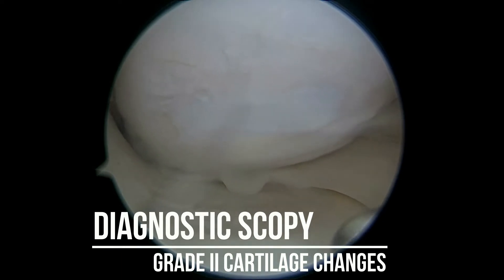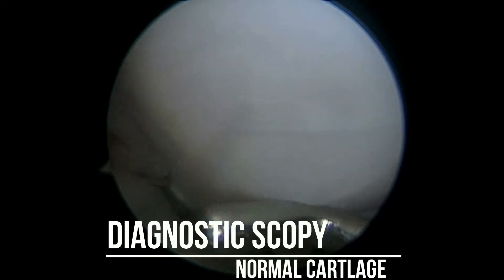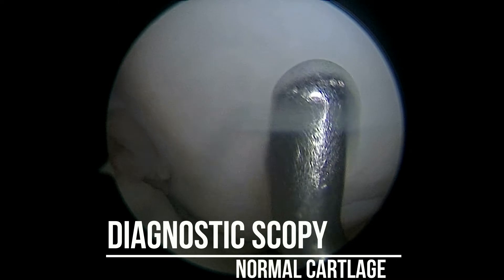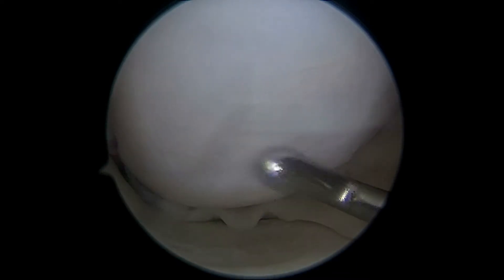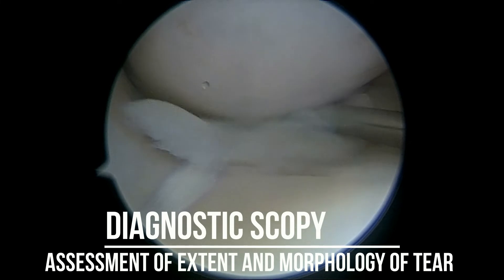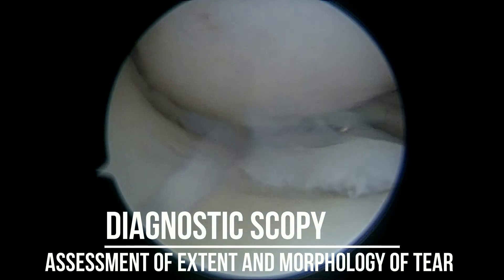There is grade 2 cartilage changes because of the meniscal injury. This is also demonstrated to the patient along with a normal cartilage area to compare, so that the patient can understand what is normal versus what defect is present in their case. This is usually the cause of post-operative pain and some persistent noises after surgery. We now assess the extent of the meniscal tear with the help of a probe.